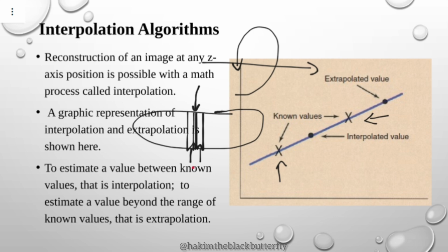If it's not done, the images created by the CT in other planes will be affected. CT gets images in axial planes, or the transverse plane. But we can do what we call reconstruction and get images in other planes, like the sagittal and the coronal. The CT cannot acquire data in sagittal or coronal.